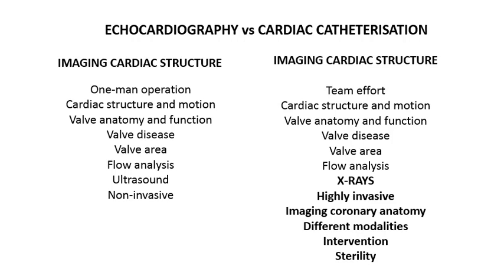And it can incorporate different modalities. We can have echo images imported while we're screening. We can import CAT scans and other types of modalities to assist in the interventional side of the procedures, which is probably the major difference between the cath lab and the echo lab. The echo lab is diagnostic. The cath lab is also an interventional laboratory, and in this instance, sterility becomes predominantly important, just like an operating theatre, a surgical environment. That's just a brief recap about the differences between a cath lab and an echo lab.